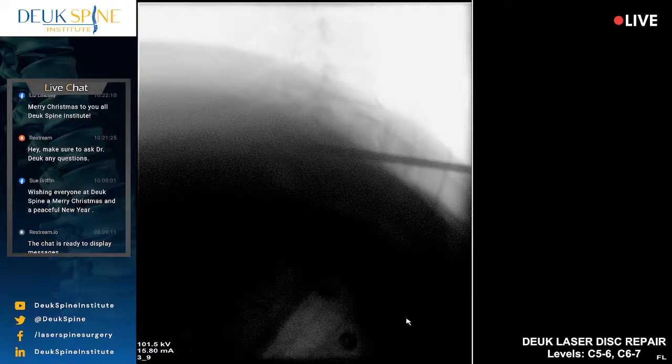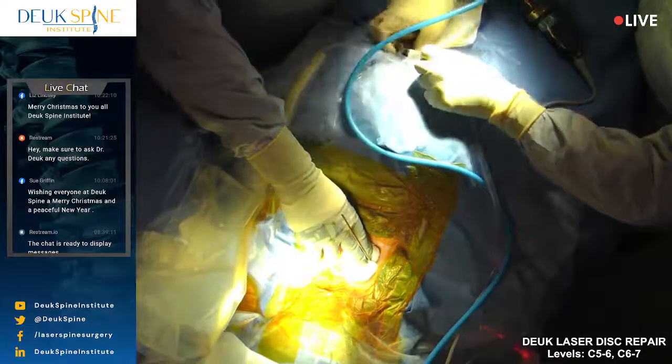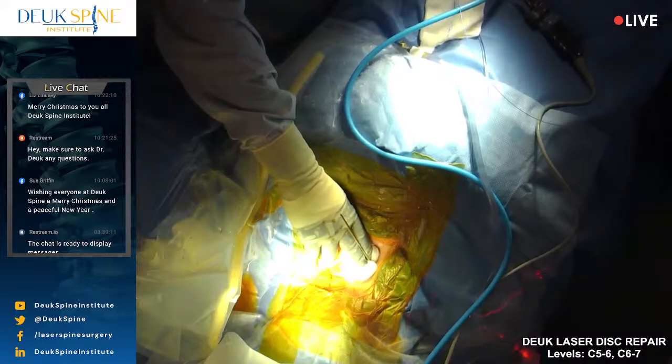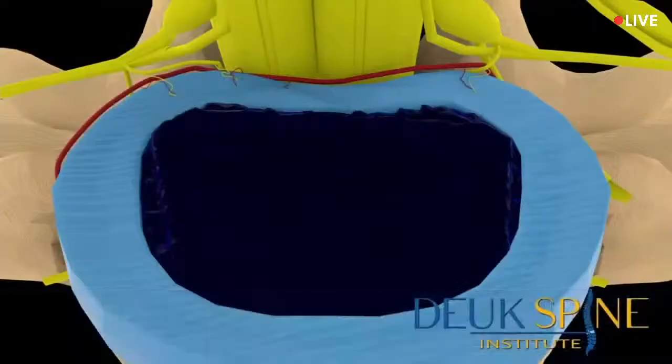Go ahead and go lateral. Okay, let's show the audience that tube that we just did the whole surgery through. You guys see this tube, Diego? Yes, sir. For the people that came in late, why don't you run the video, the animation on why people get neck pain and arm pain or headaches from a herniated disc in the neck. Can you run that video?